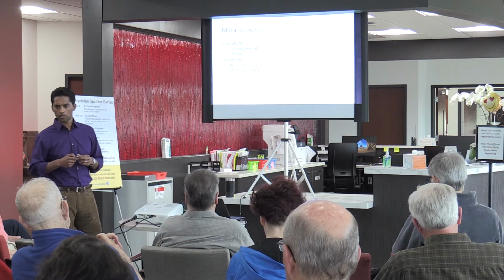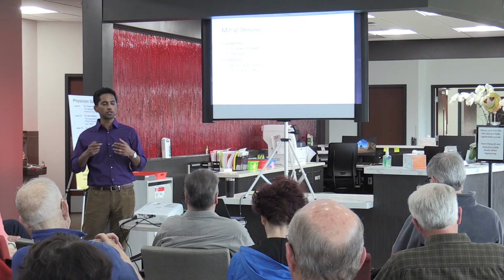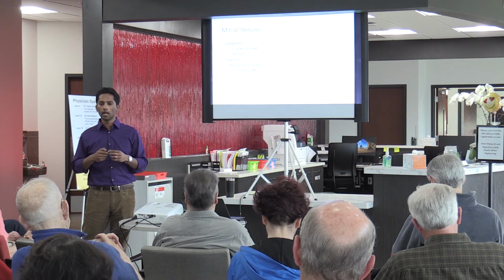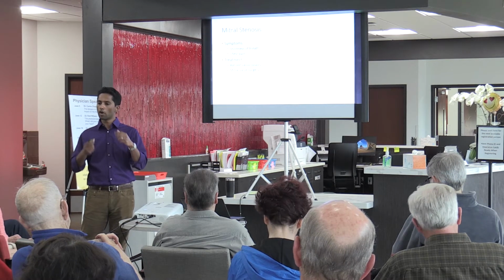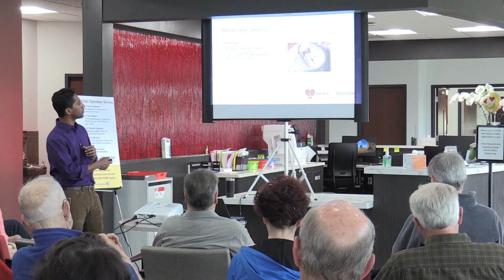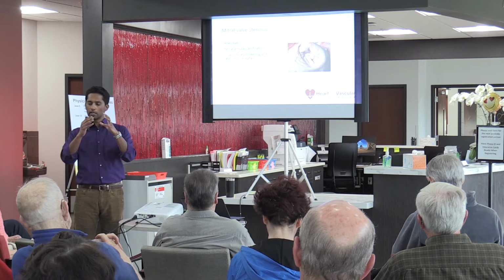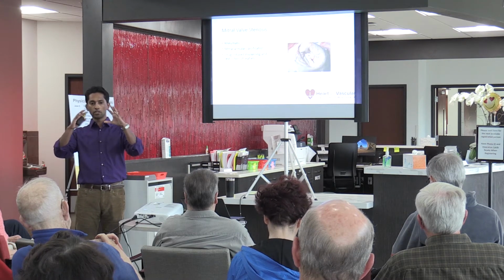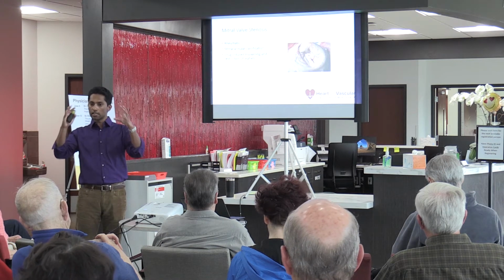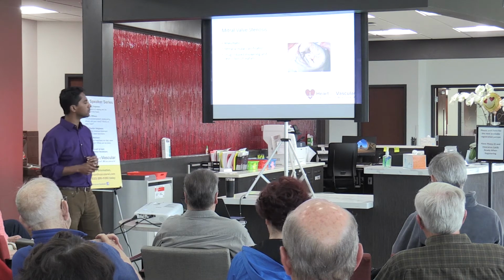Treatment options for mitral stenosis, depending on what your mitral valve looks like, right? There are certain evaluations we do for how thick it is, how much calcium it has. Using a balloon to try and stretch open this valve can sometimes be an option. So you essentially put a balloon across this opening, and then you inflate that balloon to try and stretch open that valve, thereby trying to increase the size of that opening. You're allowing more blood to flow, and try to help with the symptoms that way.